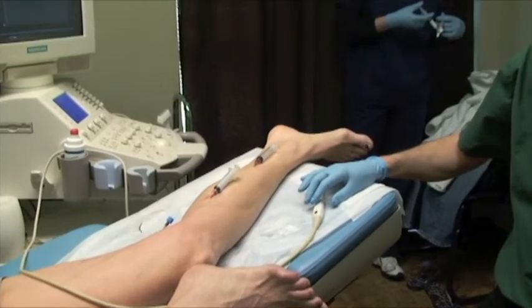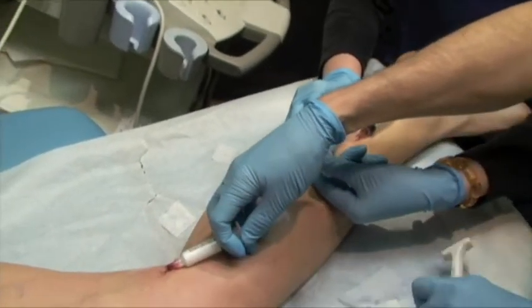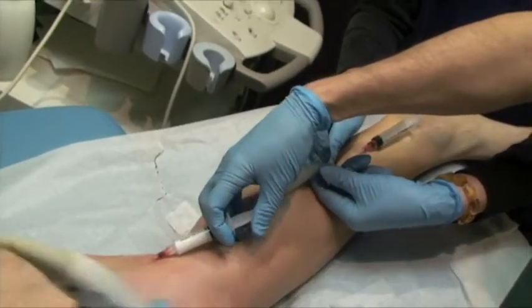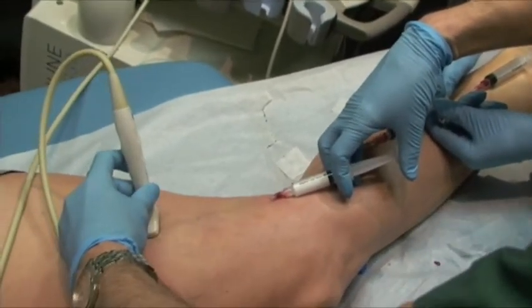Raising the leg to about 20 or 30 degrees. I will then place the ultrasound probe right over the perforator vein.